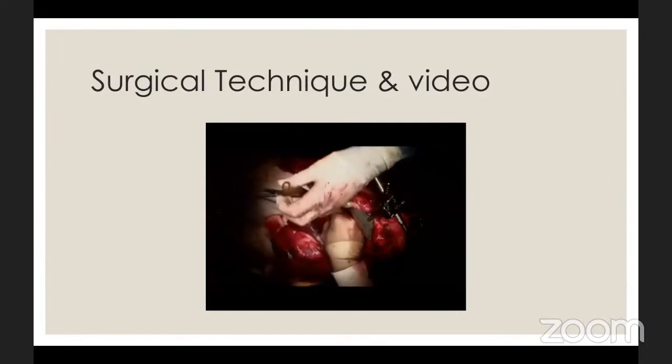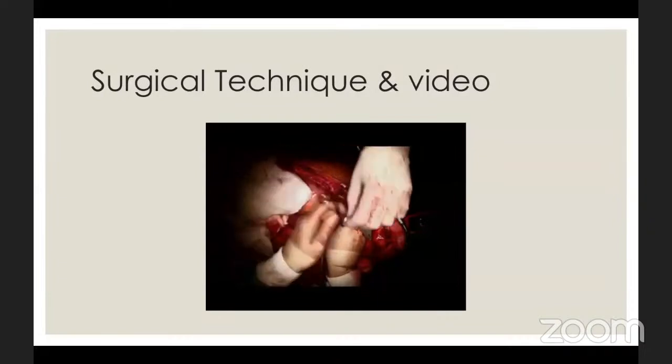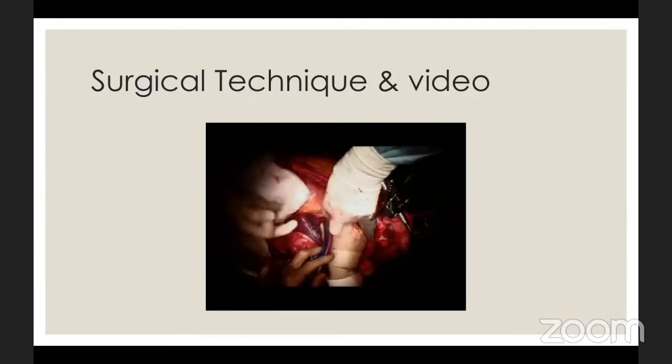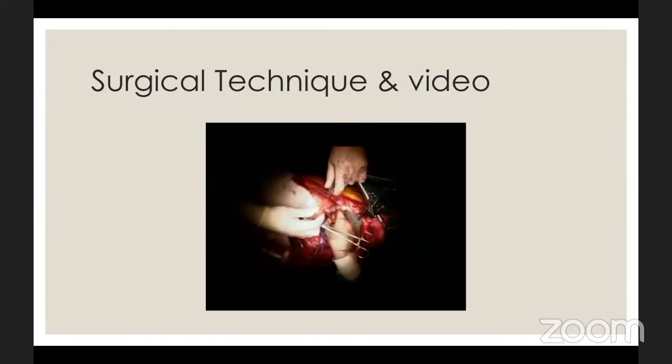The surgeon introduces the cannula at an angle, where the assistant occludes the end of the cannula with the thumb to prevent air being sucked into the left heart. A clamp can also be placed on the end of the cannula. So both techniques are possible.